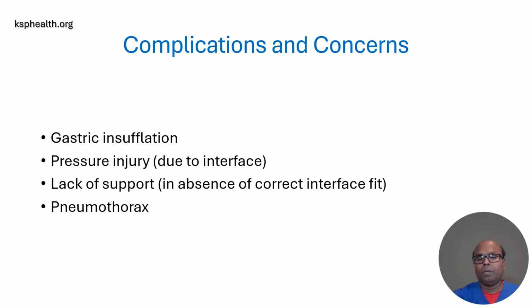What are the complications? One, gastric insufflation. It often happens with bilevel with face mask or nasal mask. Pressure injury because of the interface. Oftentimes it happens on the bridge of the nose and also the bony prominences in the cheeks. And sometimes it can cause pneumothorax.